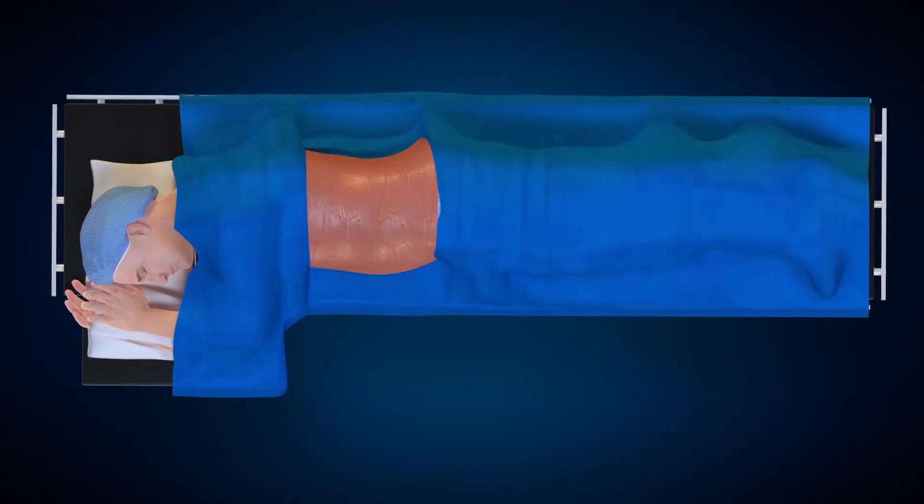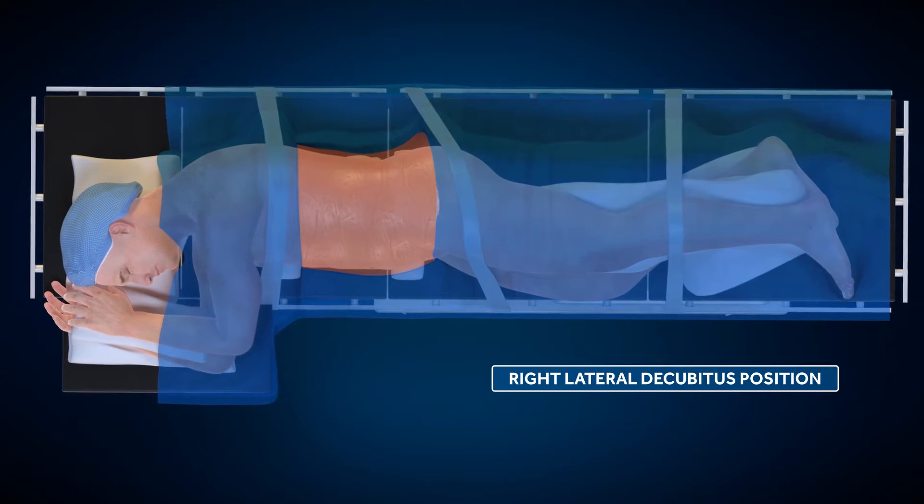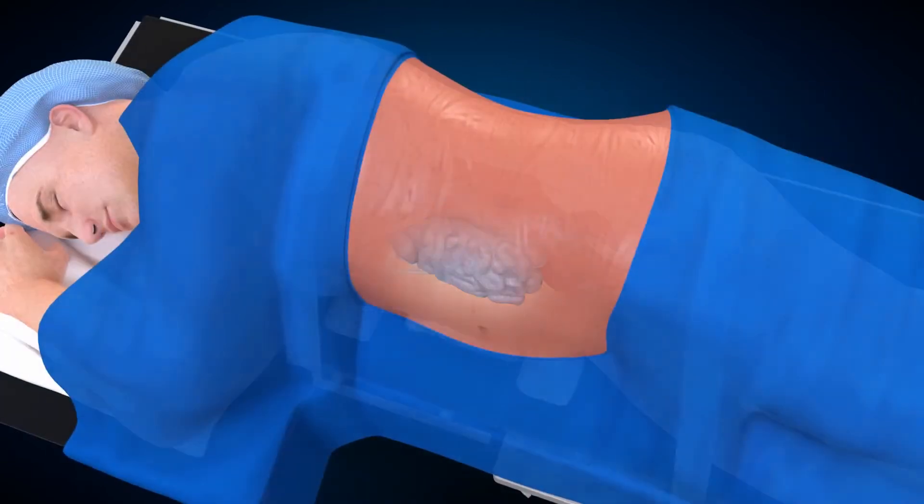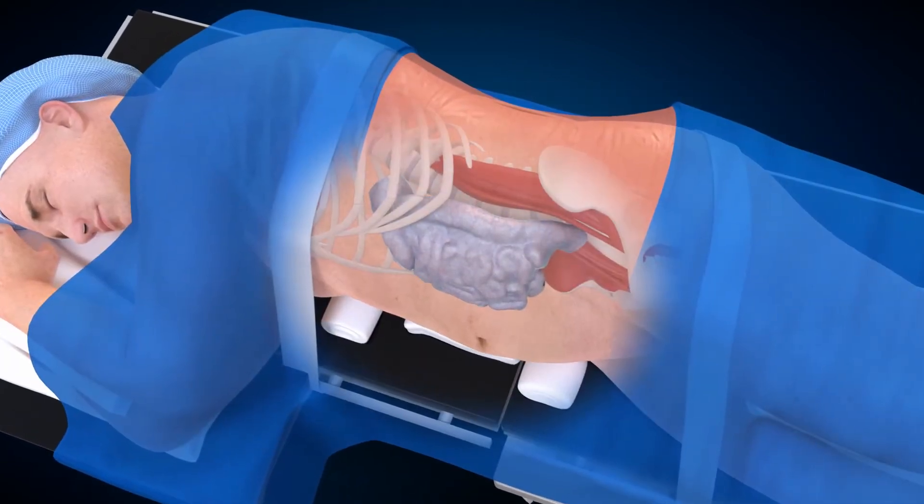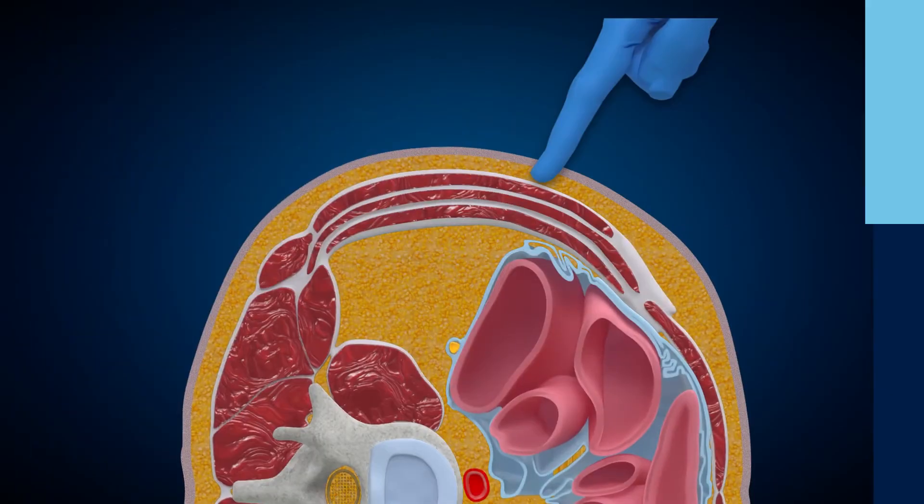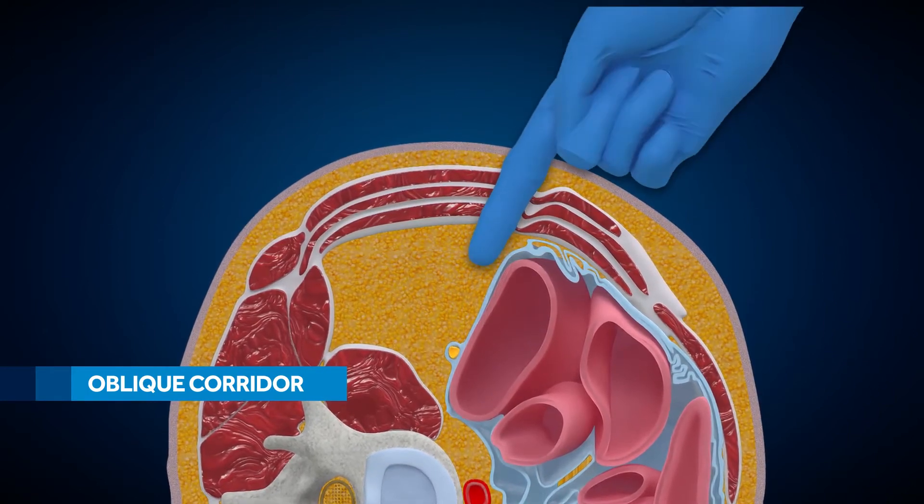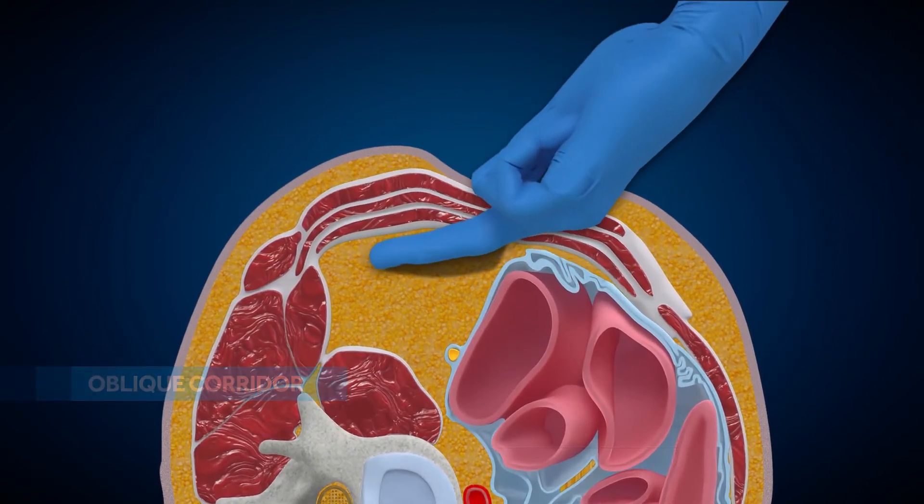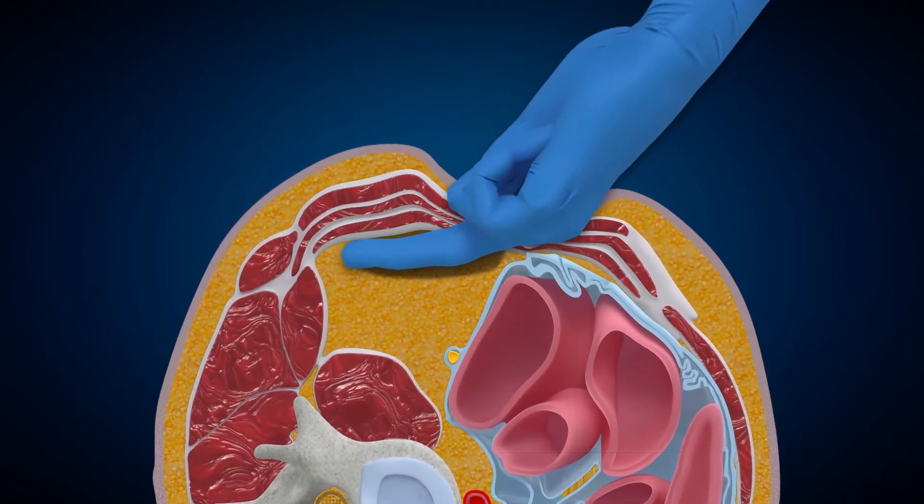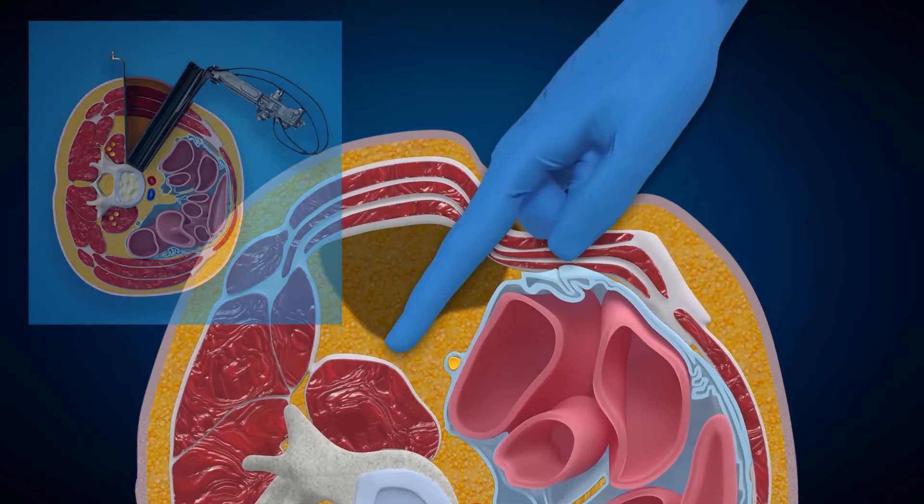In an OLIF-25 procedure, the patient should be placed in the right lateral decubitus position to approach the oblique corridor. The peritoneal contents will fall anteriorly due to gravity. The finger or blunt instrument enters the retroperitoneal space from a more anterior position, pointed posteriorly to skive the top of the peritoneum. The peritoneal contents can now be swept anteriorly, creating the oblique corridor.